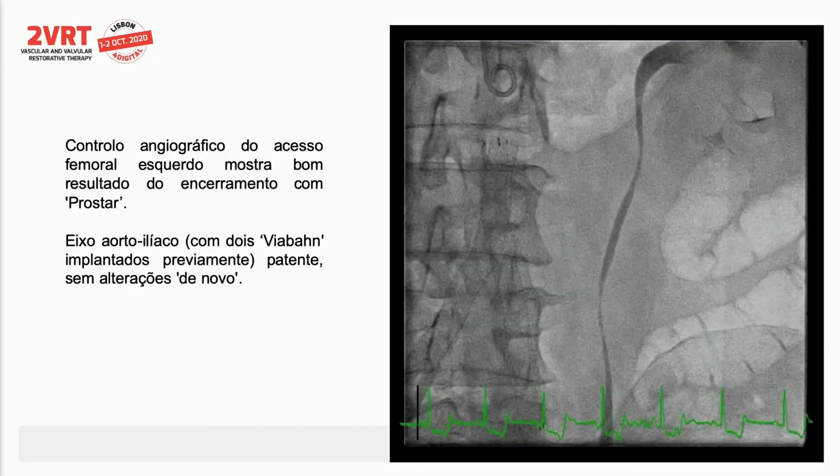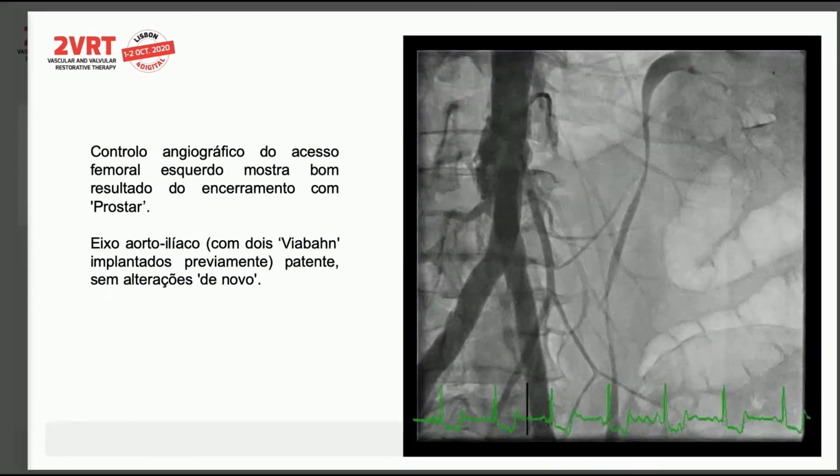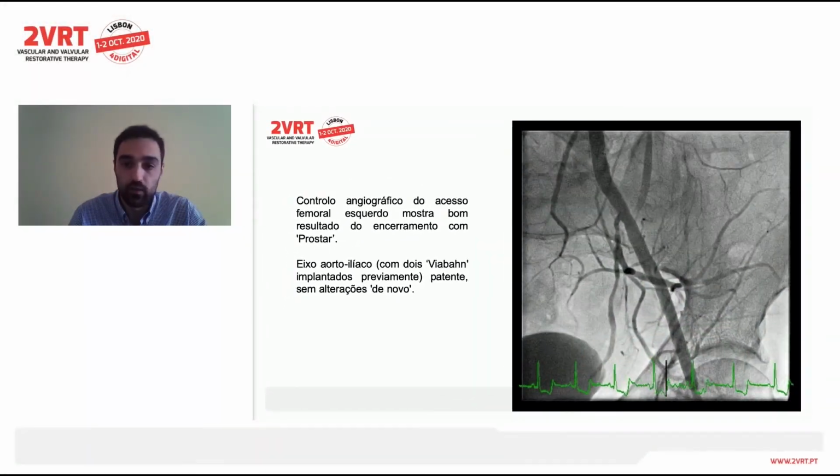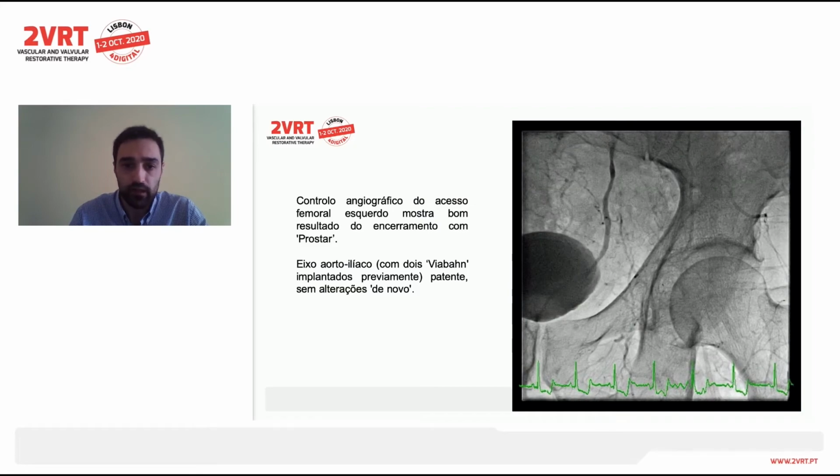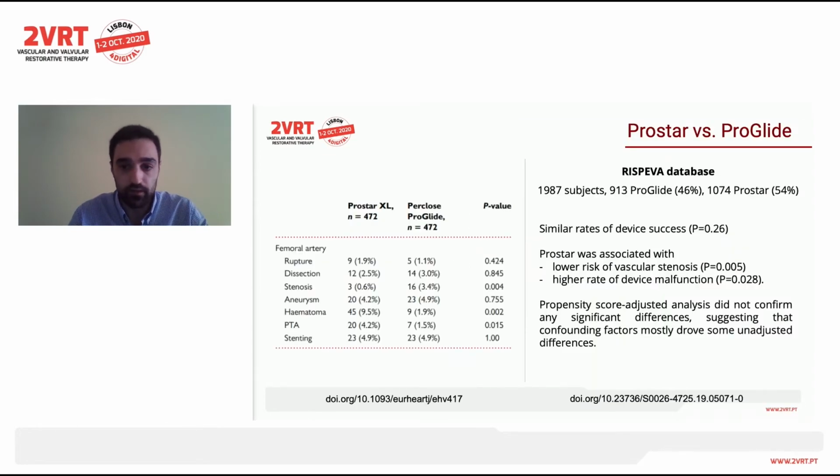And the final angiographic control showed the aortoiliac axis with no de novo findings, and the left femoral artery with good result also with this closure with ProStar, no stenosis, no contrast extravasation or other complications in the immediate setting.